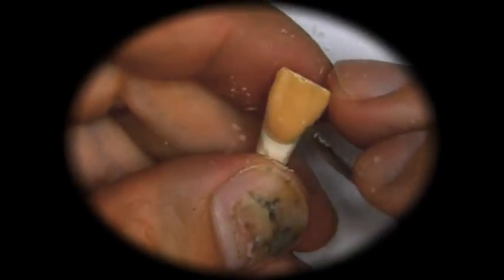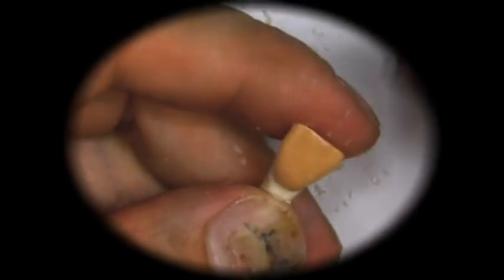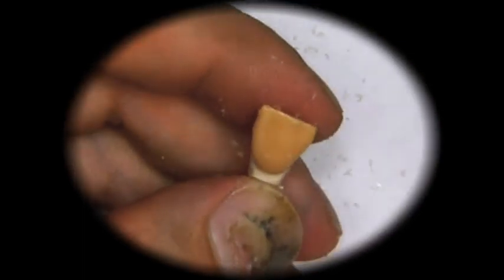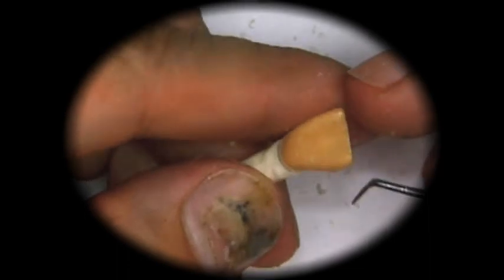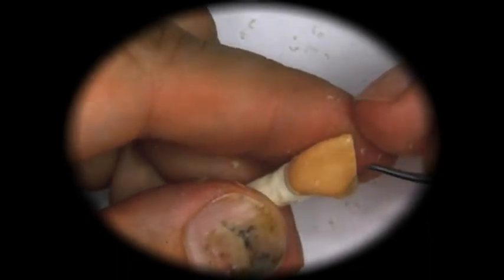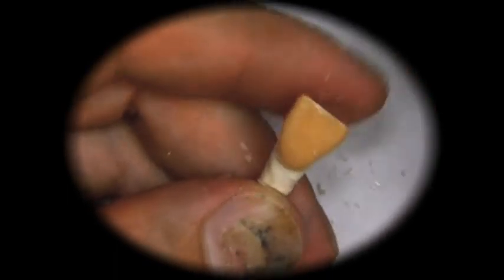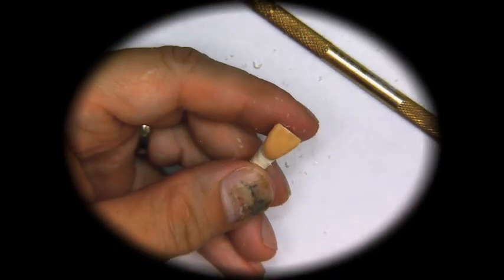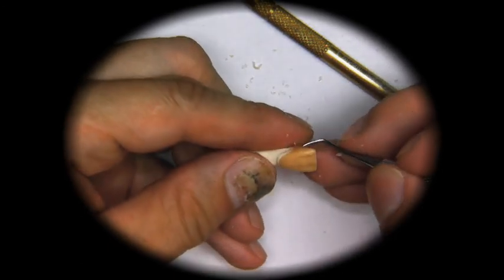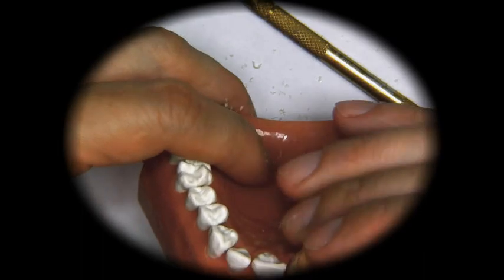You see, right? We create a slight S shape, and then here I can use my other instrument to create a convex shape right here. Concave here, convex there, which creates an S. Now let's see what it looks like.